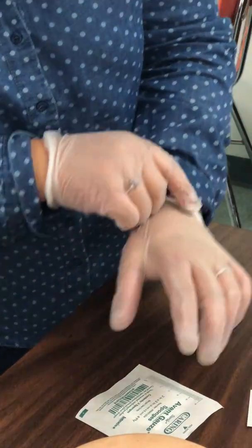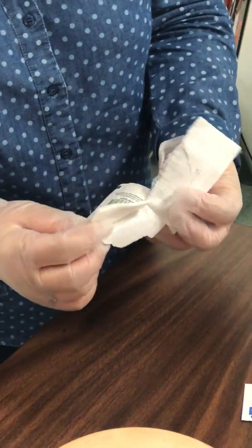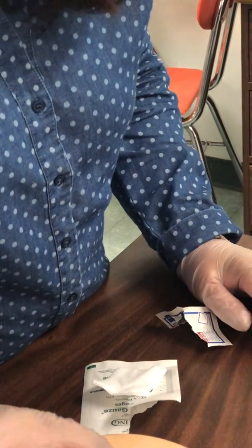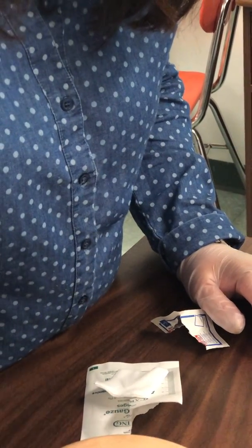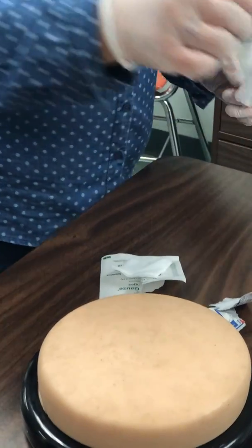So we're gonna open this. I have to ready this. We can put it over here. All right, and then we're gonna open this. And this is in to out, right? You will wait for it to dry, which we're not gonna do during the performance exam because it's gonna take forever. All right. This is an IM.